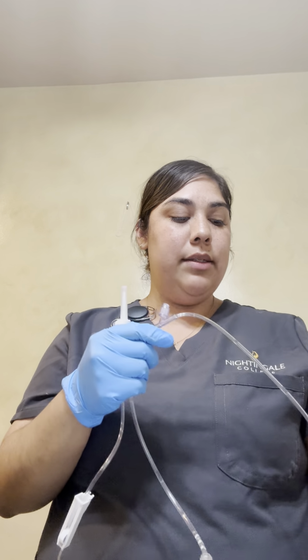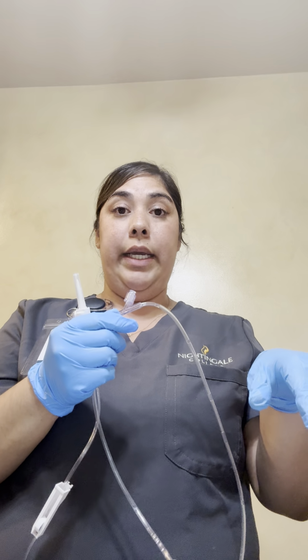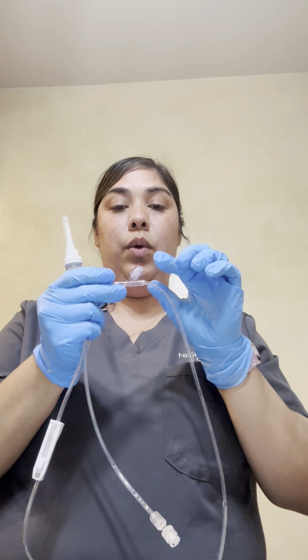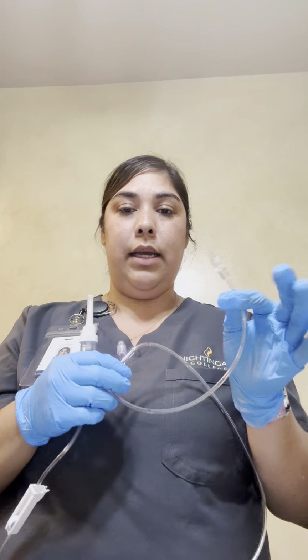This is where you'll have the second tubing, which is this one, where the medication is, because the first one, the main line, will be the fluid. The medication, the second bag, and the second tubing will go here. And of course, we would sanitize before we connect. And this would be our main port that goes straight into the IV access, IV port.